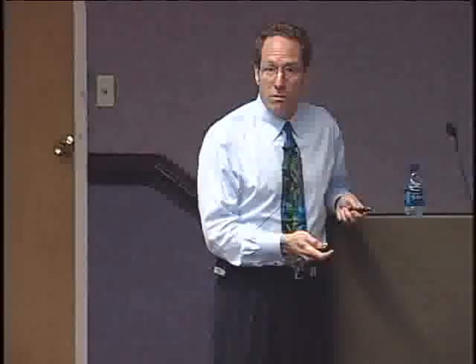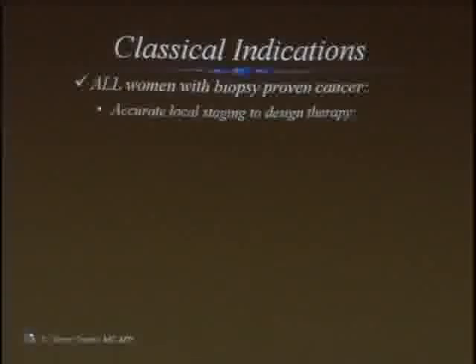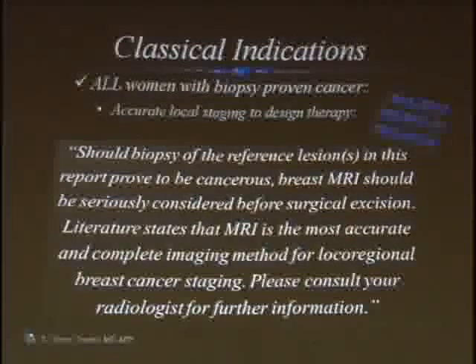Classical indications changed that day. Let me say that again. The classical indications changed that day because of this paper. Some women with biopsy-proven cancer needed a breast MRI to get accurate local staging to design the appropriate therapy. As a result of that paper, the new guideline said, all women. That's a big leap, big leap.